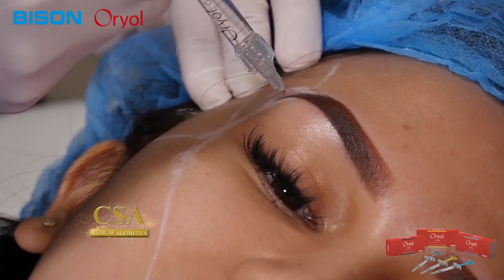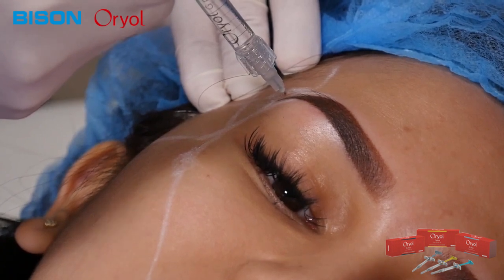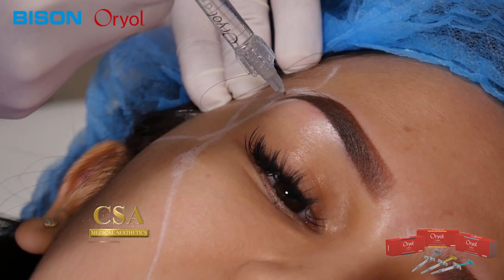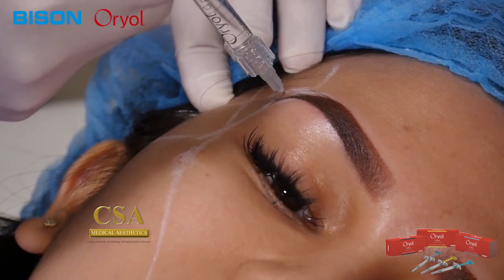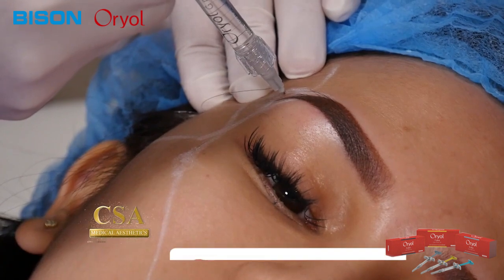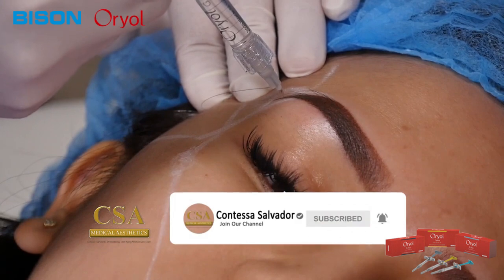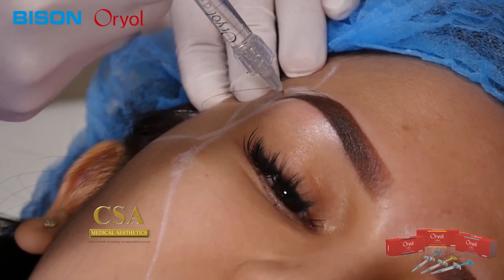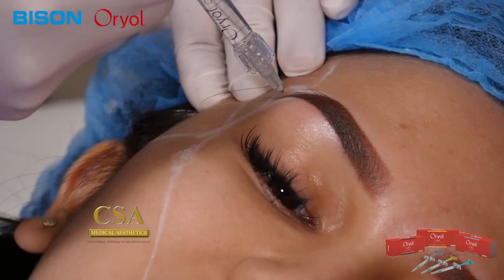As to the amount of how much you're going to inject, it will depend on how sunken the area is. So if it's mild to moderate, like around 0.5, 0.8, but if you notice that it's really severe, really very hollow, you may add. You can even use 1 ml on each side. So slow push only and onto the bone. My goal is to restore the volume as well as lift the corner of the eye, as well as the tail of the eyebrow, and restore the fullness of the temple.